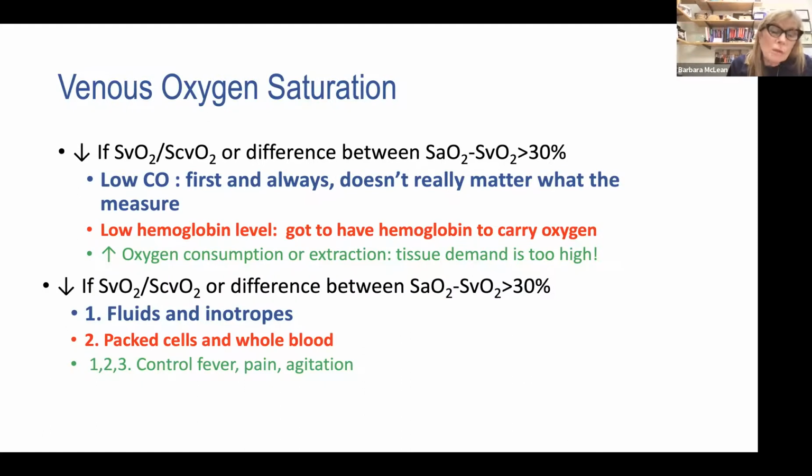Now, the problem is that when you're doing it intermittently, you can't really measure quite as well what you're doing. And what that also means is you can't do one SvO2 in the ECC with a critical patient in shock, and it comes back at 45 and you do all sorts of interventions, but you never measure the SvO2 again. You should be measuring the SvO2 every hour. After every significant intervention, you should measure SvO2.